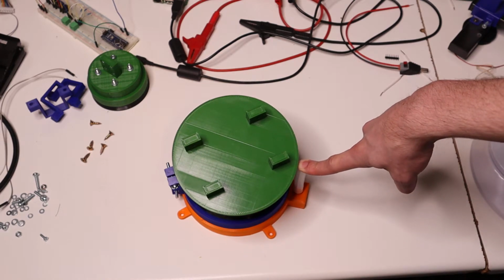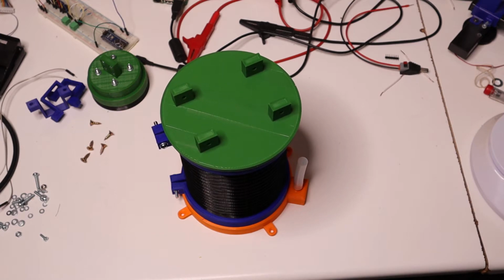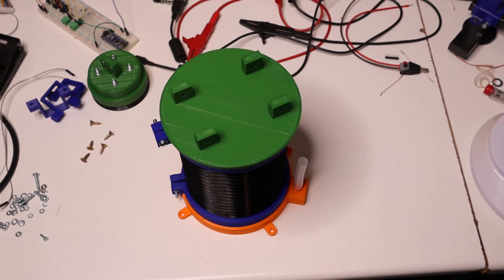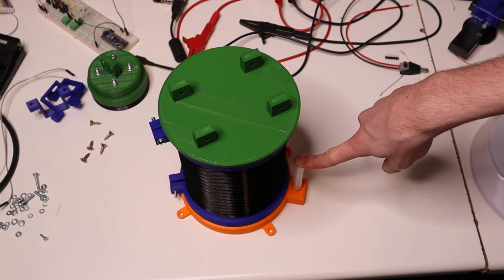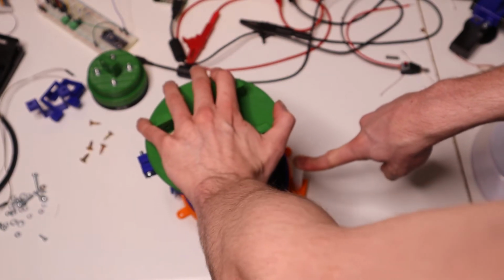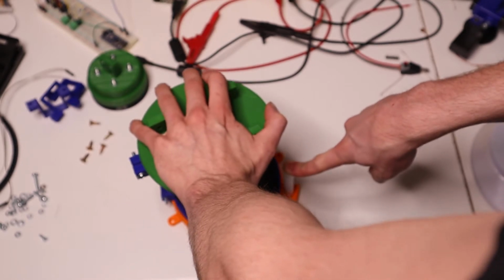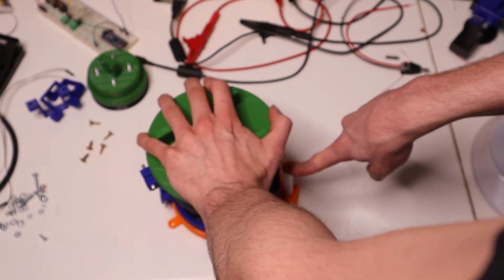And just for comparison now, if I let go, that's how quickly it goes up. Now you can also test this in reverse, essentially. So I'm going to seal it up again with my finger, and I'm going to push down on this thing. And you can hear that something is leaking out, and I can definitely get this bellows down.